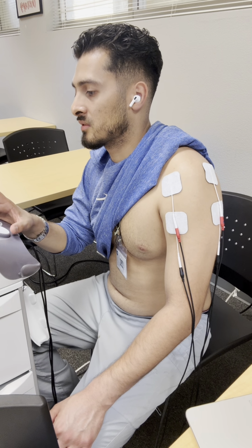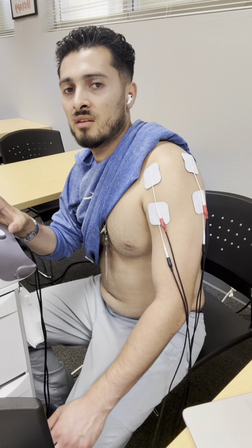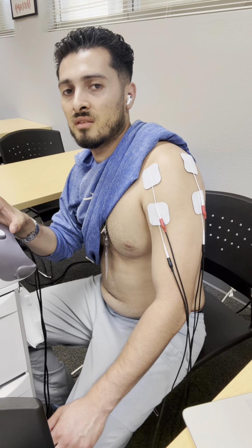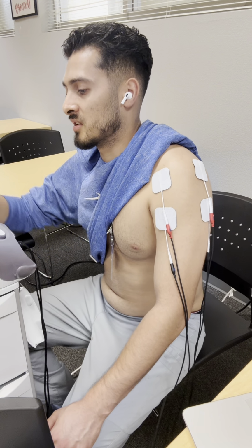So a lot more buzzing on one end versus the other end. So on these two channels right here, I'm feeling the contraction pulsing, and then on the other channel, I'm feeling just more of a buzzing sensation.